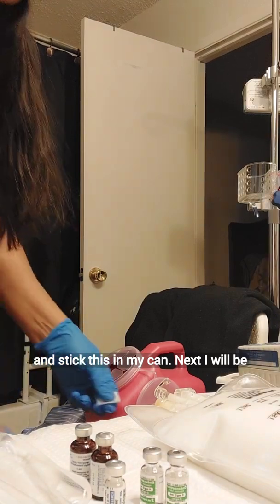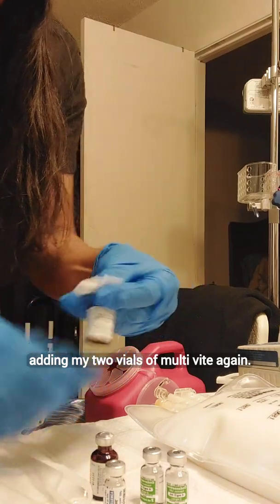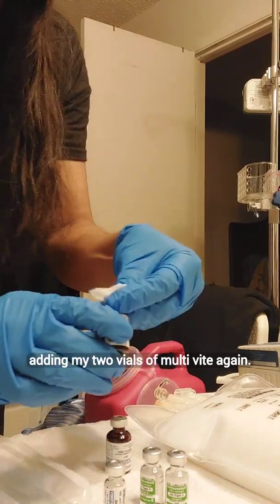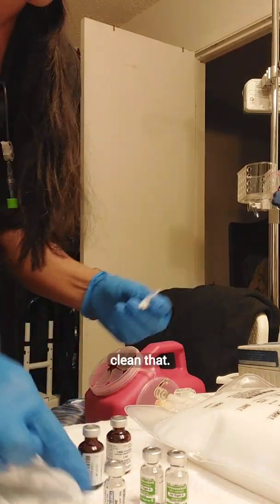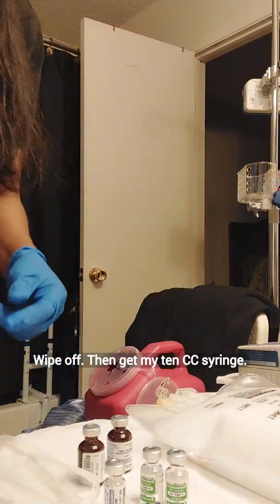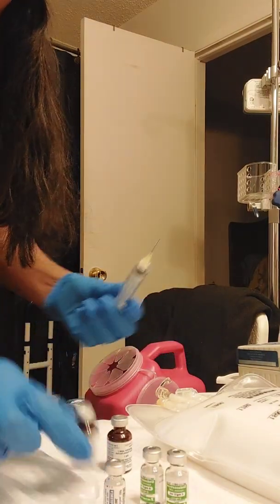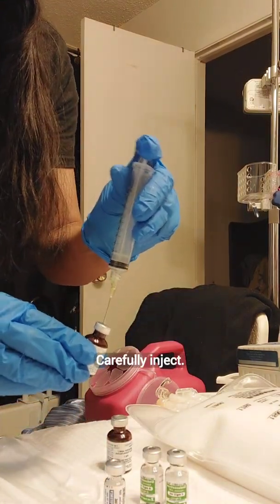Next I will be adding my two vials of multivitamin. Again clean that, wipe off the end, get my 10 cc syringe, and carefully inject.